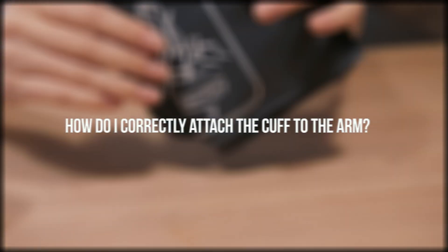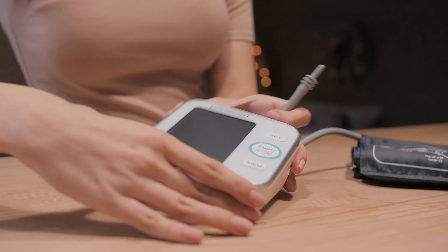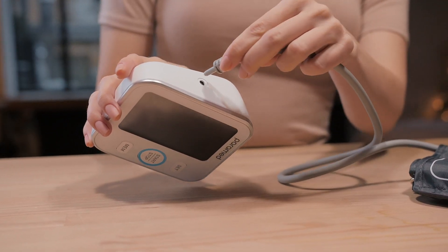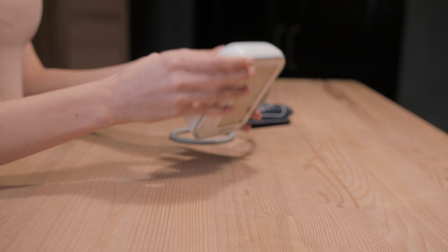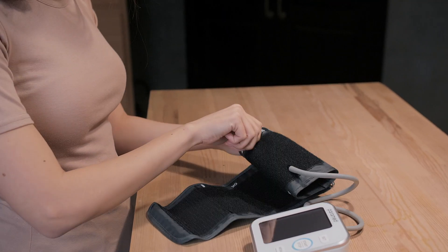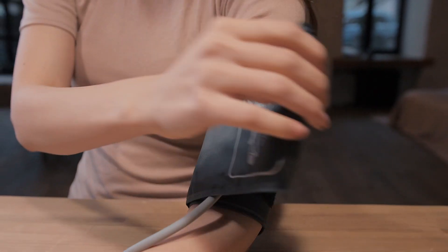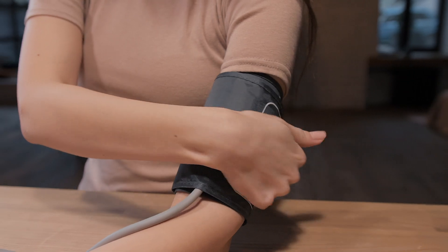How do I correctly attach the cuff to the arm? Before switching on the device, sit up straight at a desk, place your feet on the floor, and relax. Wrap the cuff around your left arm above the elbow so that its edge is 2-3 cm from the elbow joint and the pipe is directly in the middle of your arm.